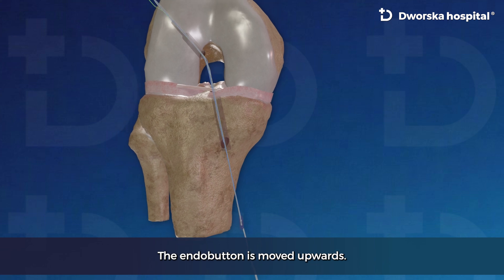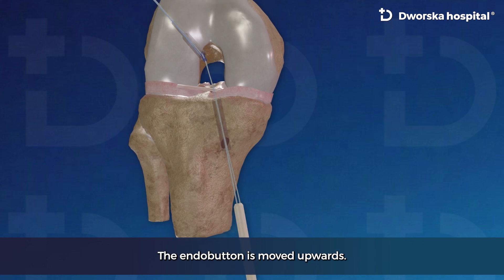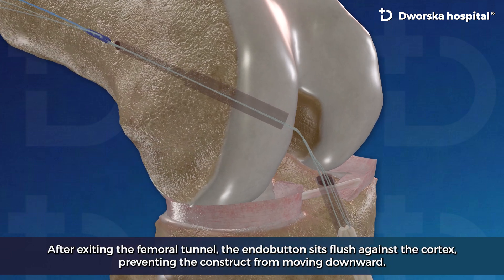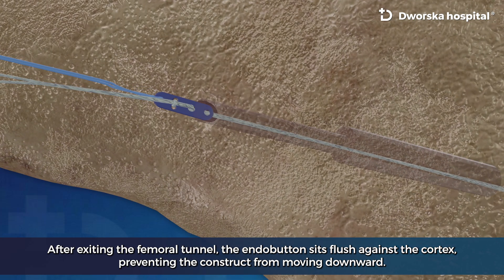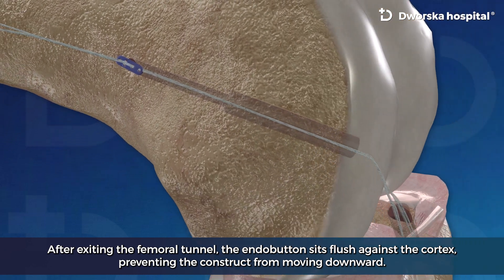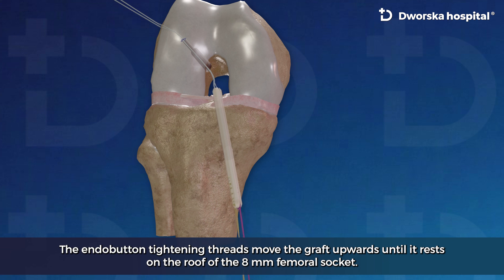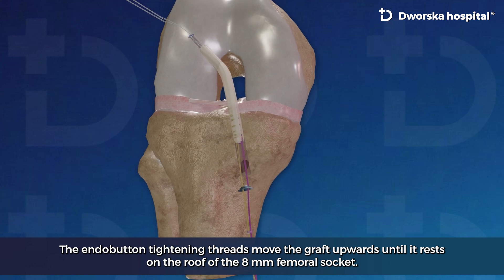The endo button is moved upwards. After exiting the femoral tunnel, the endo button sits flush against the cortex, preventing the construct from moving downwards. The endo button tightening threads move the graft upwards until it rests on the roof of the 8 mm femoral socket.